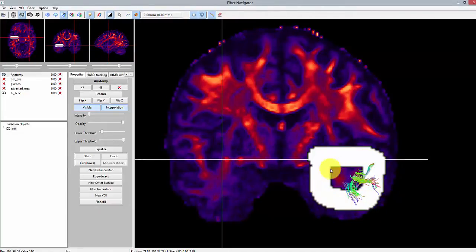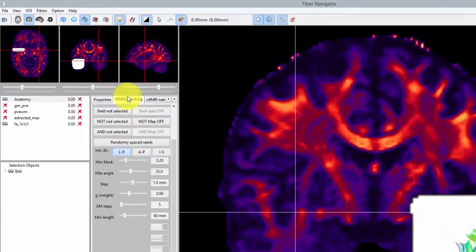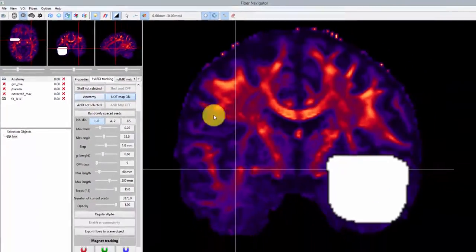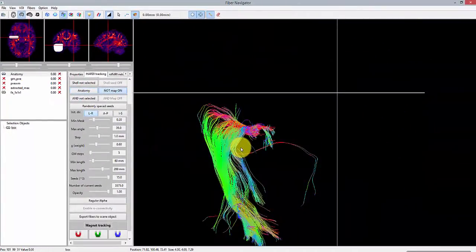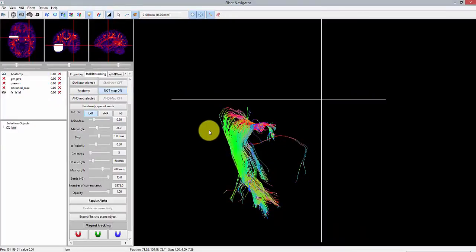Another option would have been to draw a target region of interest located in the visual cortex. We might also want to get rid of these spurious streamlines.